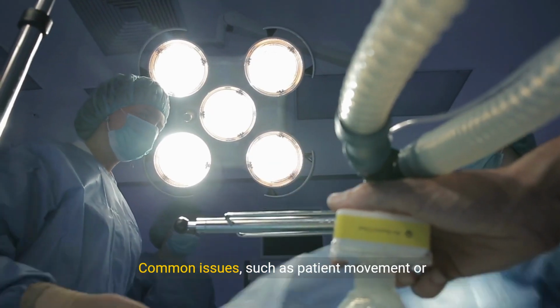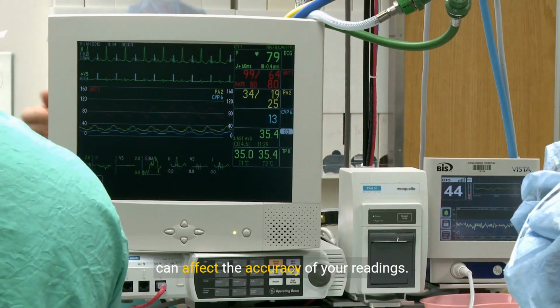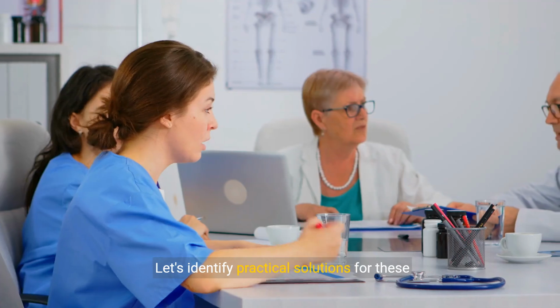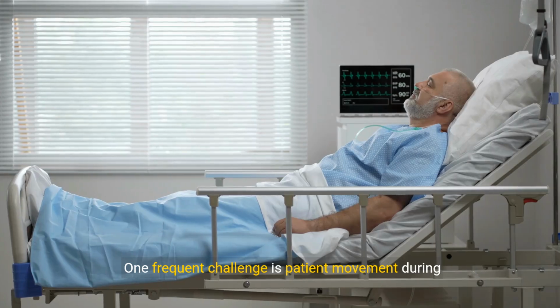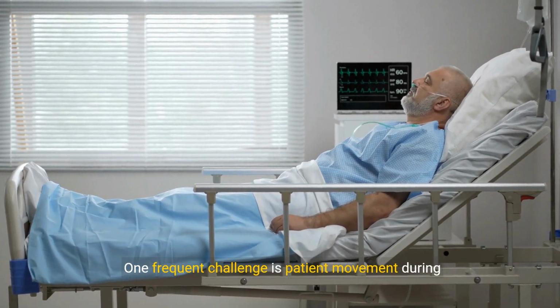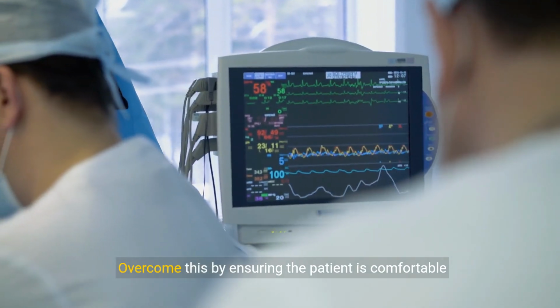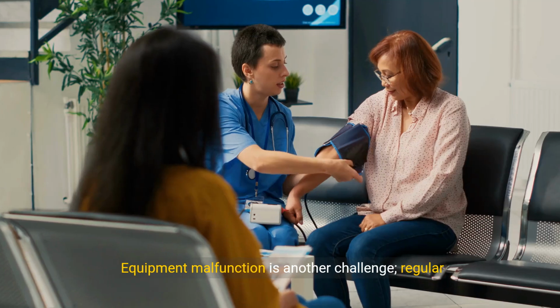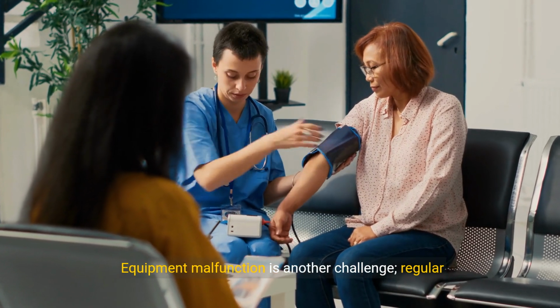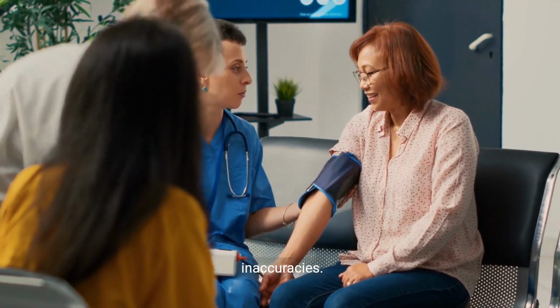Common issues, such as patient movement or malfunctioning equipment, can affect the accuracy of your readings. Let's identify practical solutions for these challenges. One frequent challenge is patient movement during the procedure. Overcome this by ensuring the patient is comfortable and giving clear instructions beforehand. Equipment malfunction is another challenge. Regular maintenance and calibration help prevent inaccuracies.